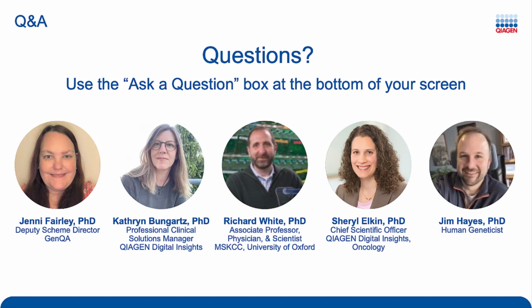All right, next question. Have you looked at the level of discrepancies in functional classification, i.e., whether the variant can cause cancer, versus clinical classification? In this study, Jenni, you can check me, but I think more of the discrepancy was at the clinical level. There was largely very good agreement between QCI and the expert panel on the pathogenicity or oncogenicity of the variant, the biological implications, and more discrepancy in the level of clinical implication.